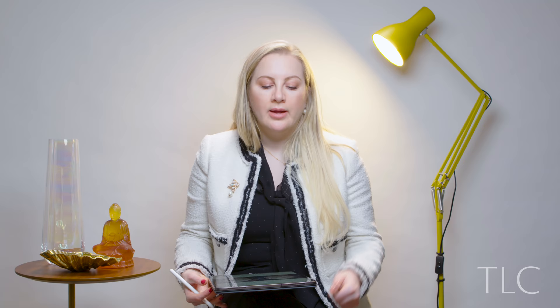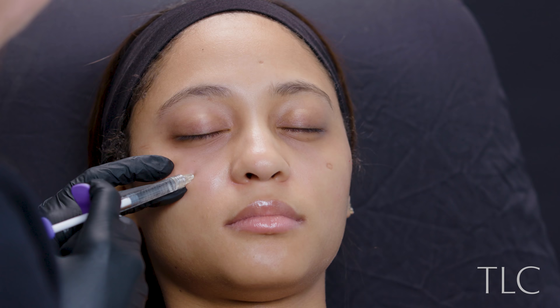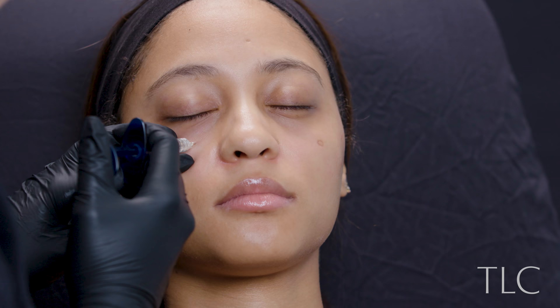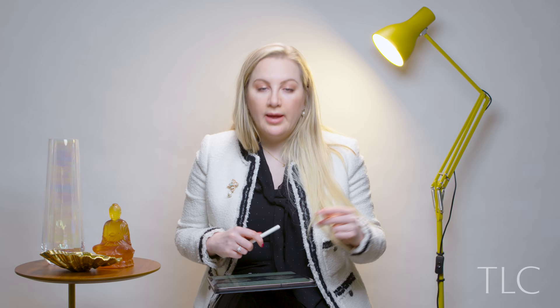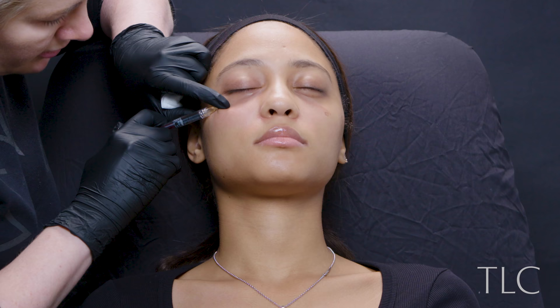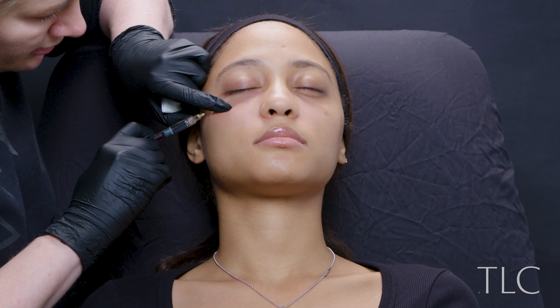The first thing was using Juvederm Voluma along the cheekbone, one syringe per side, to lift the descending skin and pin it back up. Then I used Juvederm for lift in the front part of the cheek where the two fat compartments are beginning to separate. The final step was using Teosyal Redensity 2, specifically designed for the under-eye region, directly in one part of the tear trough where she was still deficient. After that I went back in with Teosyal Redensity 1 using a cannula underneath each eye — this is more of a mesotherapy product containing uncross-linked hyaluronic acid along with vitamins, minerals, and antioxidants to support skin health.